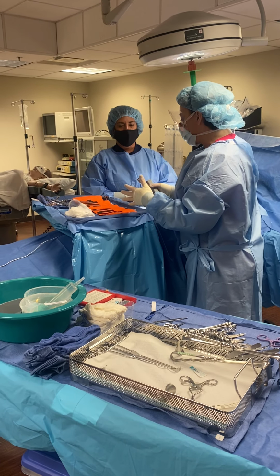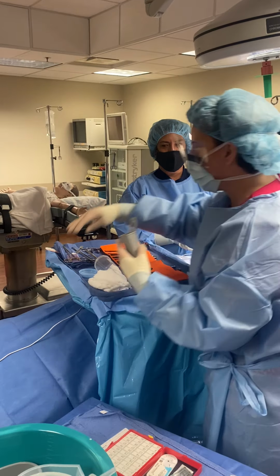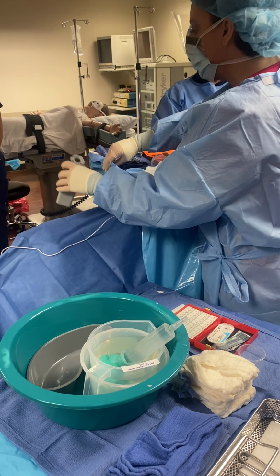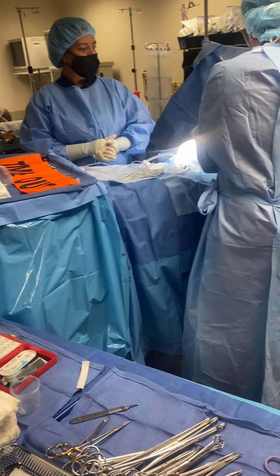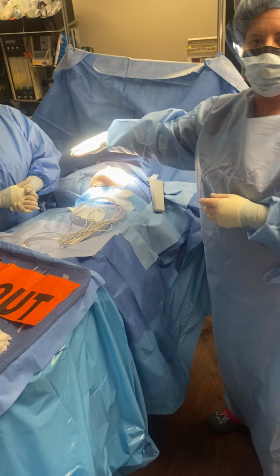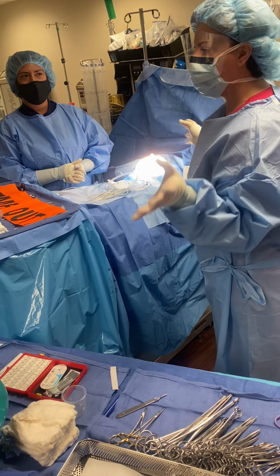There's a couple places you can put it. One is on either side of the mayo stand, but we'll put it here, but just so you can see it, lift it up and stick it like that, and then the Bovie can go in there, okay? You can also use this little hole to put it through the Velcro. I'll show you with this one up here. Now, depending on if your surgeon is left-handed or right-handed, they might want it up by their left. So the surgeon might tell you where they want it. Or you just put it wherever and they're fine with it, right?